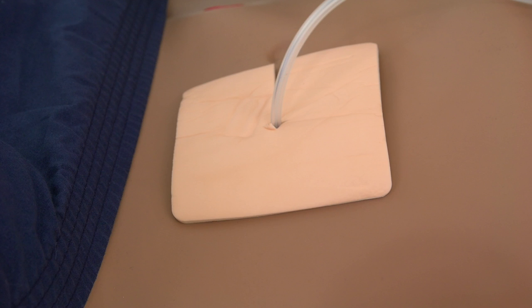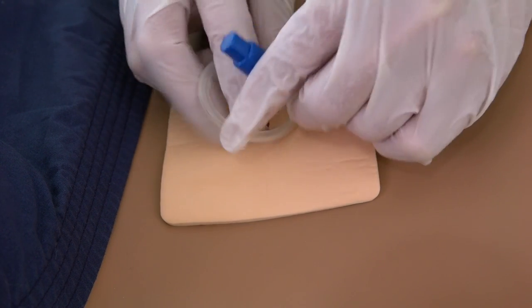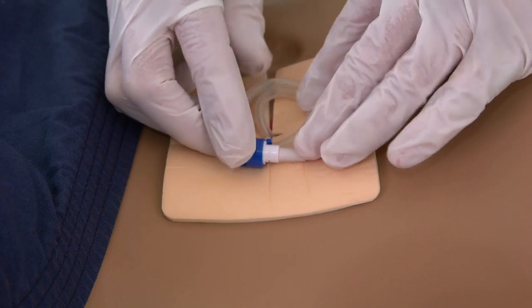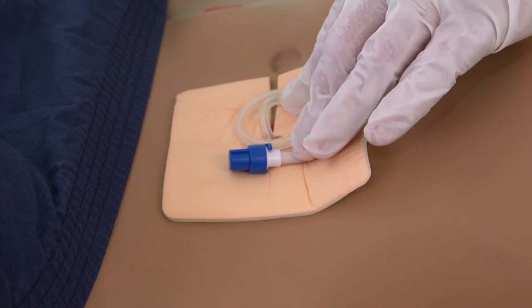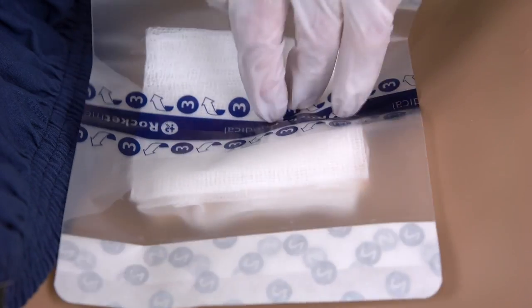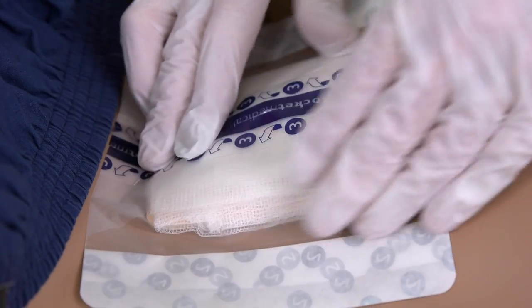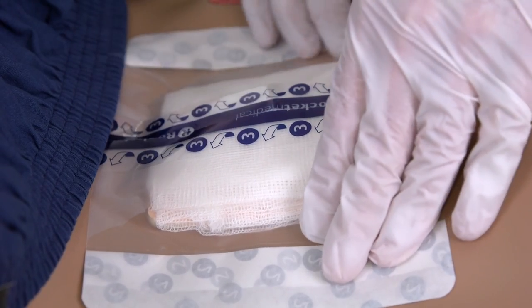Coil the catheter carefully into loops and place over the foam. Place the Seaview dressing centrally, sticky side down, covering the catheter with the gauze squares. Ensure the clear dressing overlaps the foam square on all sides. Press down firmly.